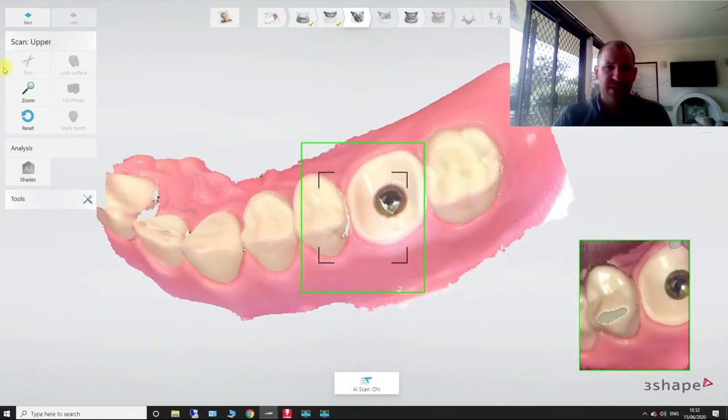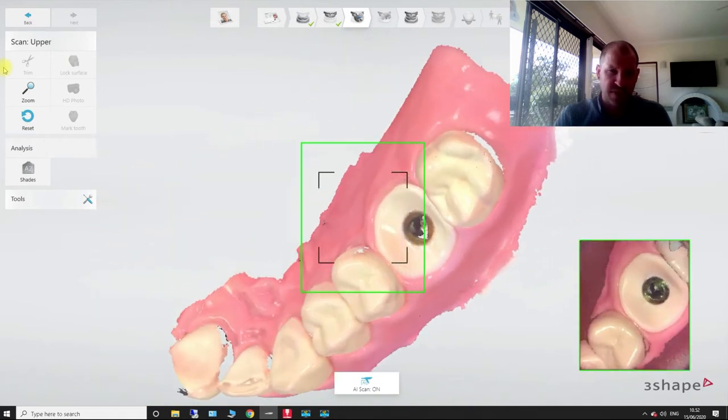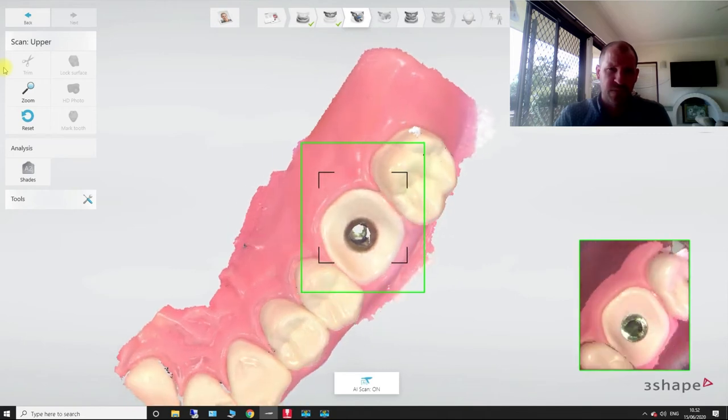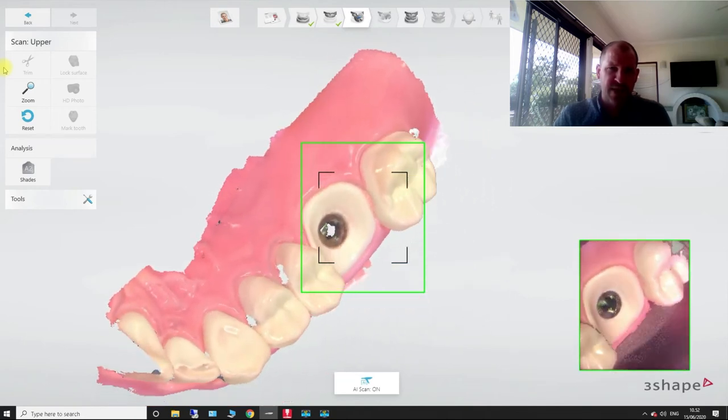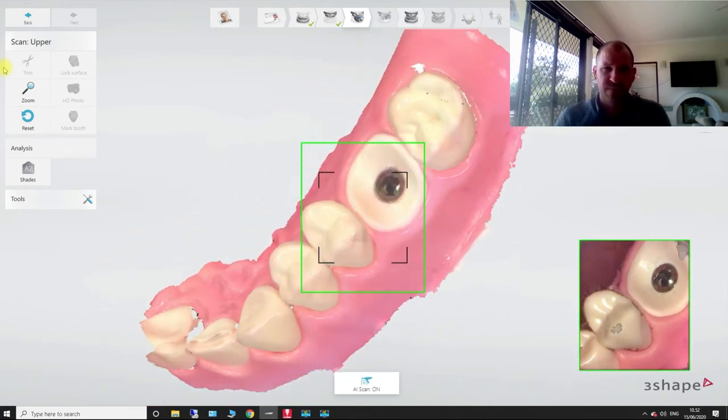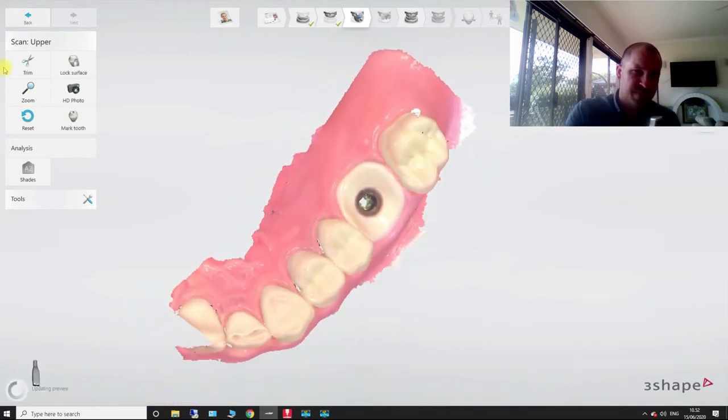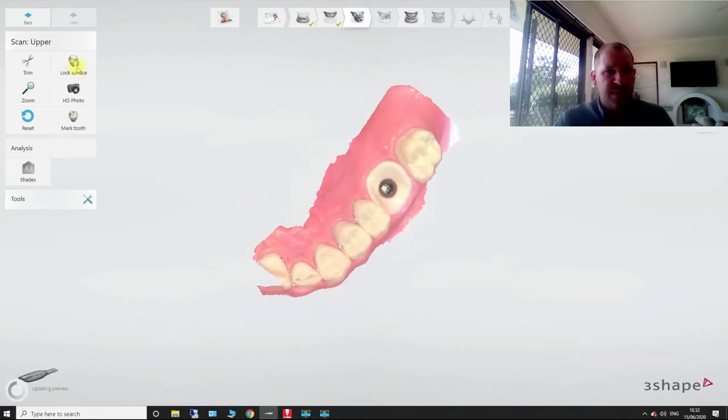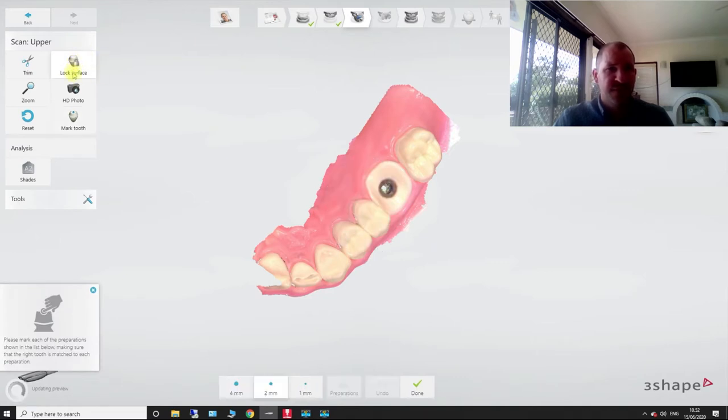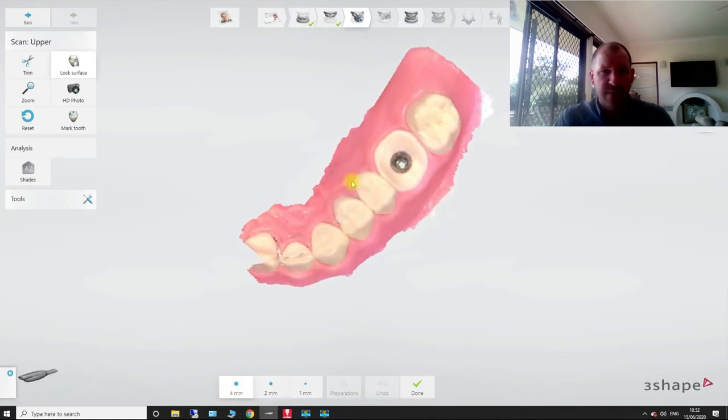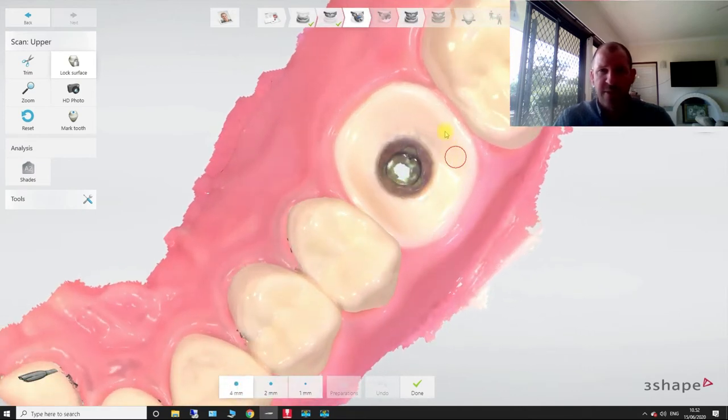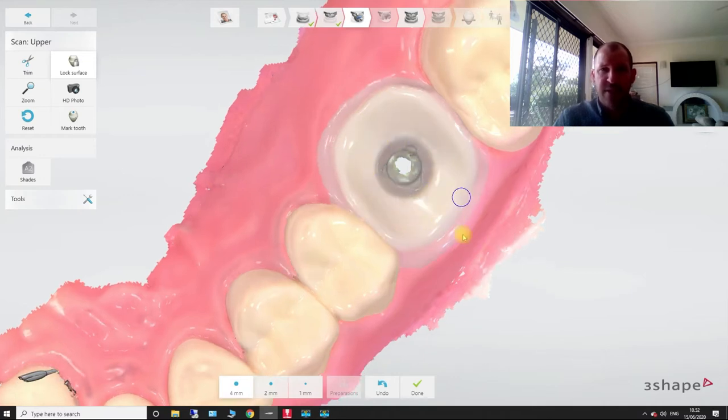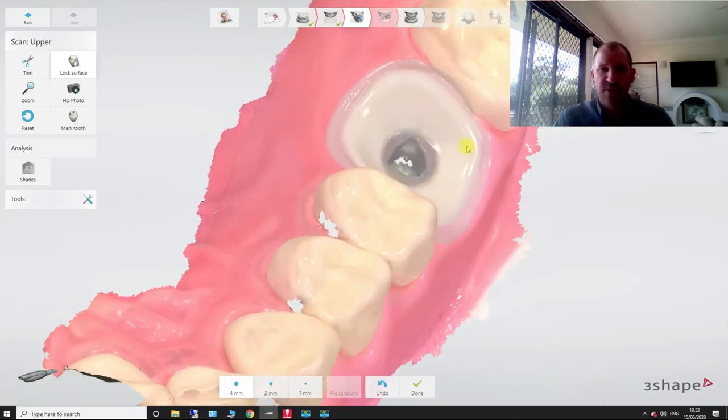So this is basically our emergence profile is what we're scanning in right now. So after we scan in our emergence profile, what I want to do is I want to come in here and I want to use a lock surface tool up the top. And I'm going to paint all around this area because if anything else gets written over the top of this, it's going to annoy me.